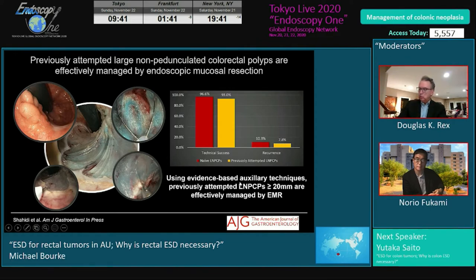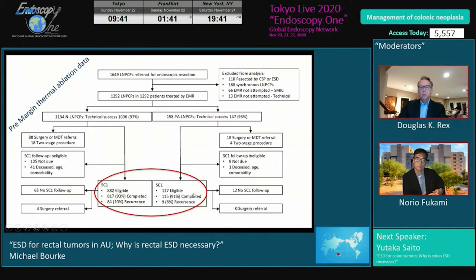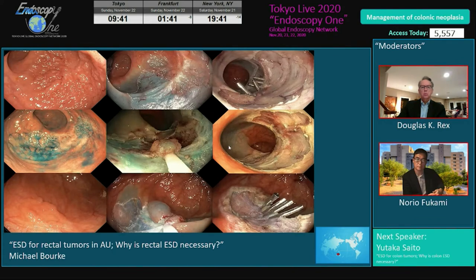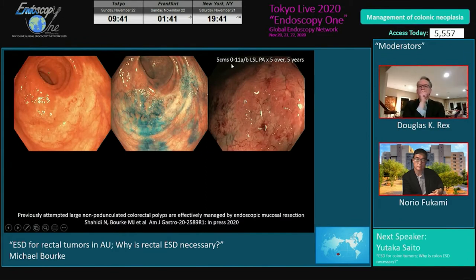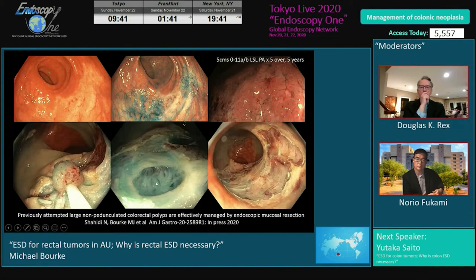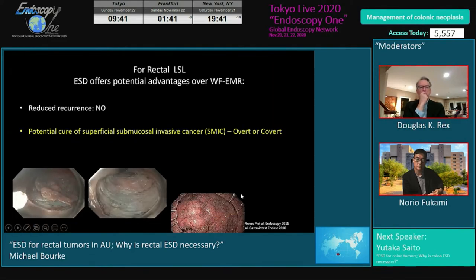Using auxiliary techniques like hot avulsion or cold avulsion, you end up with a very low recurrence rate. A lot of this data precedes snare tip, so with snare tip the recurrence rate will approach zero. You see some terrible examples of scarred lesions here — a five centimeter lesion attempted five times over five years, all scarred and terribly stuck down — but we can resect it using cast technique: cold avulsion followed by snare tip, and the lesion is completely removed.